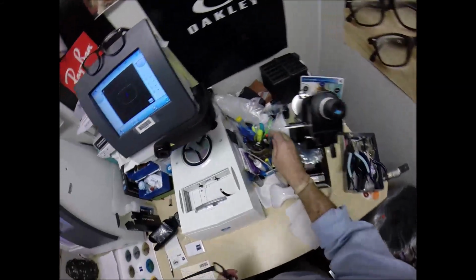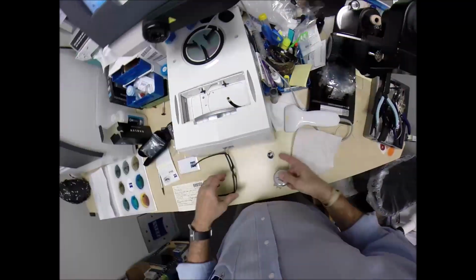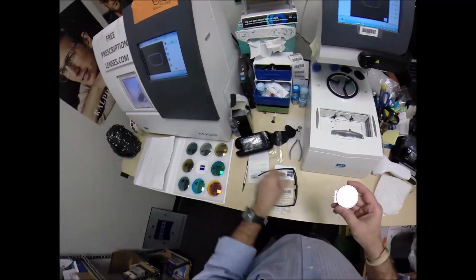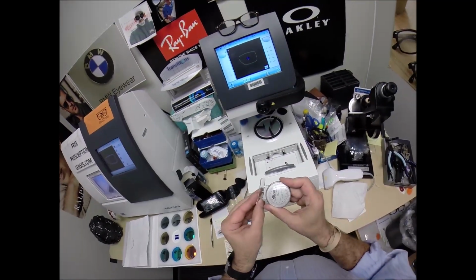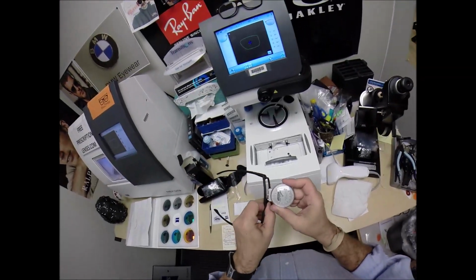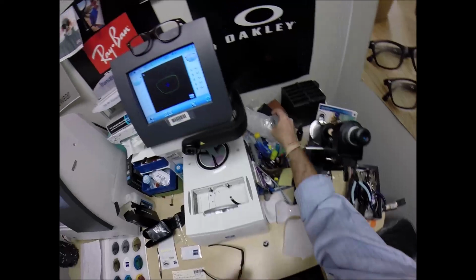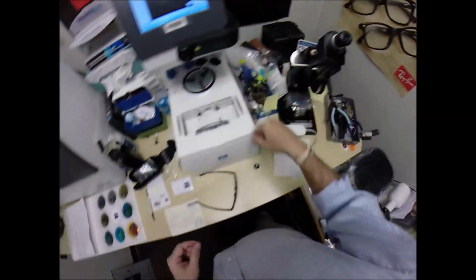And anyone who wants to do that, you just need a lens clock, of which I've got one hiding here. Look, the block came off. And you can measure the... I'm getting just 4 1/4 there. You can also measure the frame itself, and that'll tell you what size, hey, let go.